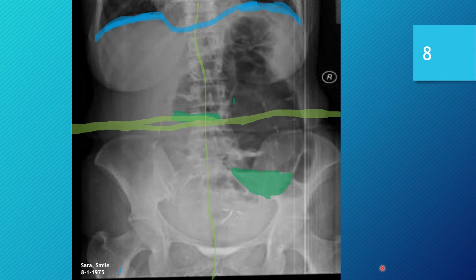So, moving on to number 3, does it display adequate exposure properties? Well, once again, the quality of this image kind of plays into this. I think the contrast is probably fine. I can definitely see differentiations between, obviously, bowel gas, solid matter, more solid matter within the bowel.